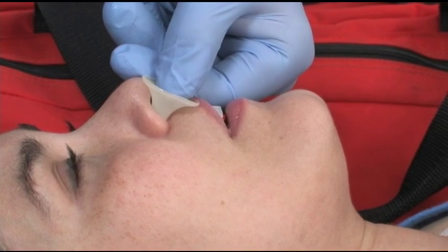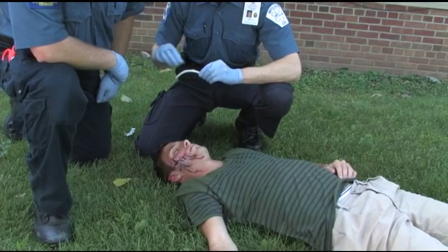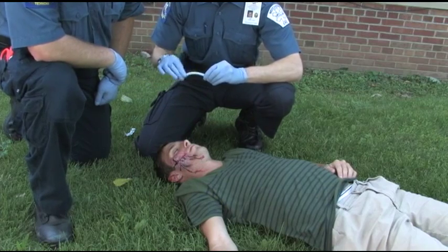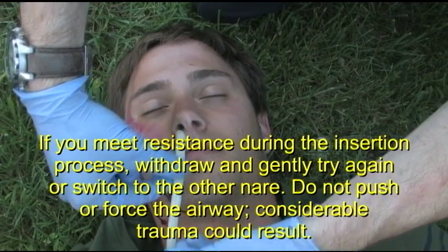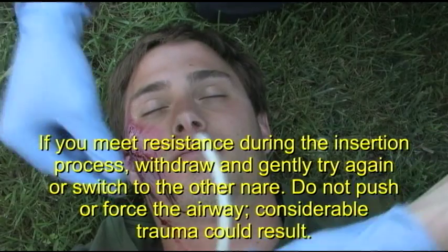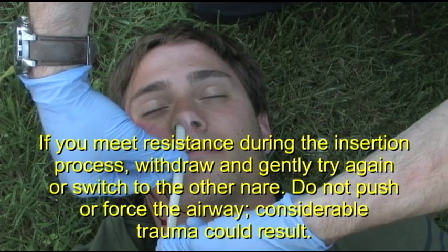If the patient should start to gag during insertion of the NPA, immediately stop the insertion. Caution should be used when inserting an airway in a patient with suspected facial trauma, and it is usually contraindicated if you have any reason to suspect a basilar skull fracture. If you meet resistance during the insertion process, withdraw and gently try again or switch to the other nare. Do not push or force the airway. Considerable trauma could result.